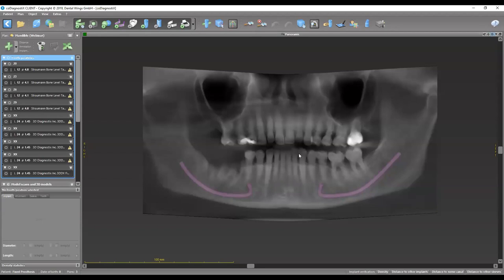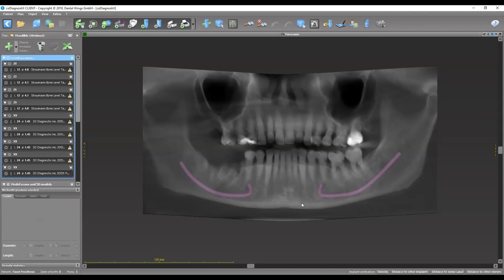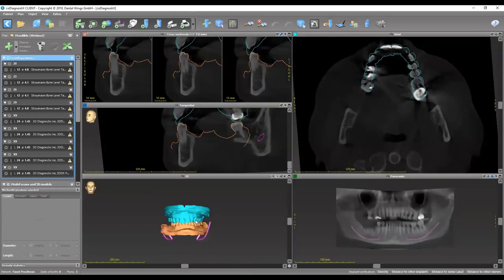The number of implants can vary depending on your preference and guidelines. Some recommend an all-on-X approach with a minimum of four implants — two straight up and down at the canine sites, and two terminal ones that are either 17 or 30 degrees distally inclined to have enough AP spread. If you have enough bone to accommodate more than four implants, you can go ahead and place five. If the bone looks better distal to the foramina, you can actually place up to six, seven, or eight implants that are all straight up and down for better AP spread.